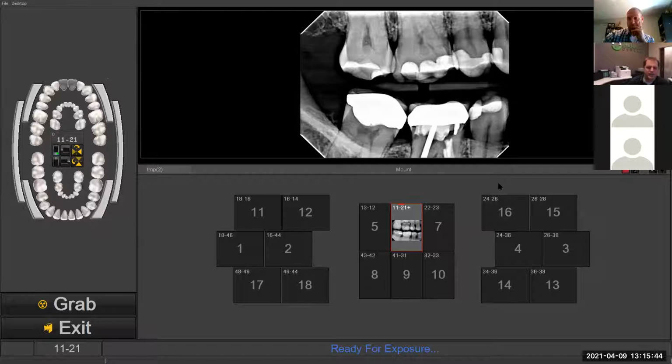Yeah, I think it was an IP address issue, as far as knowing where to route it to, but we'll get into that later. I'll let you keep going. Yeah, we'll be able to work out all those little kinks and things over time, but I'm pretty confident that we could deal with that.